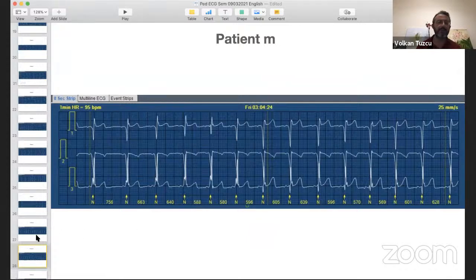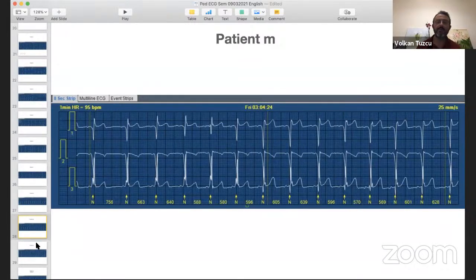then what happens? Suddenly something changes, right? What did change? Pre-excitation, okay. What happened? Is it intermittent? All right. Because the QRS changed, right? It became narrower. Did pre-excitation disappear? Look at the first lead and second lead. It's interesting, right? If you look at the QRS on the first one and second one, look at all three leads. Do you think it's still intermittent pre-excitation?